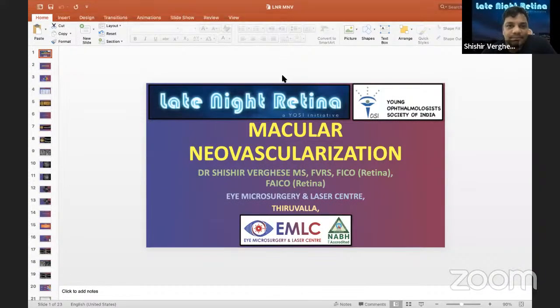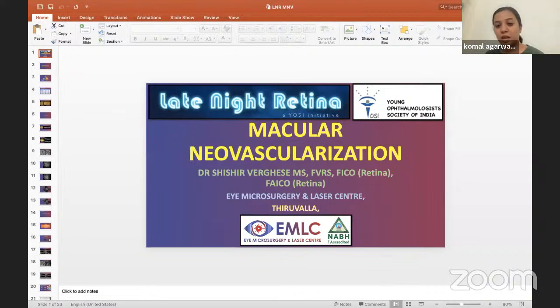Yeah, thank you. Over to the panelists for discussion. Thank you, Dr. Shishir. That was very interesting and a pretty rare case to see a choroideremia, and that too again with a CNVM. Very notably in a 13-year-old, the choroideremia is so much advanced that we have only the macula left.